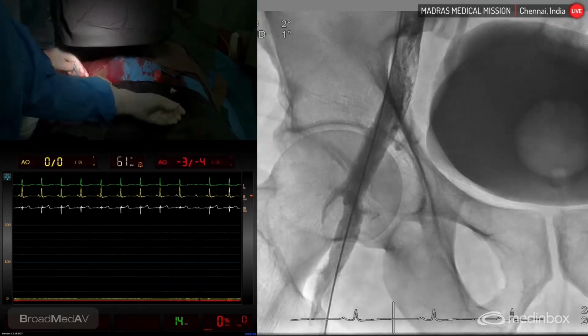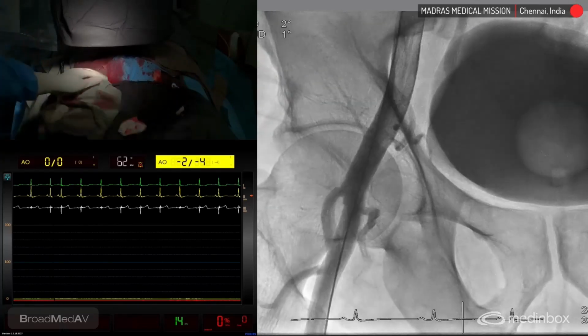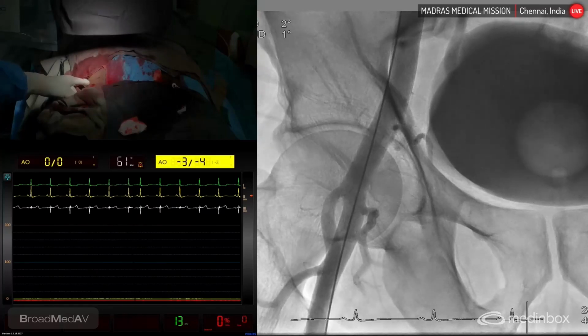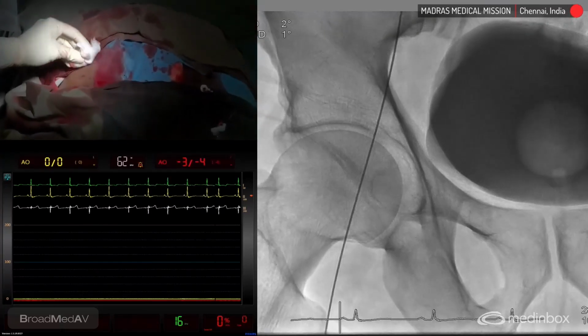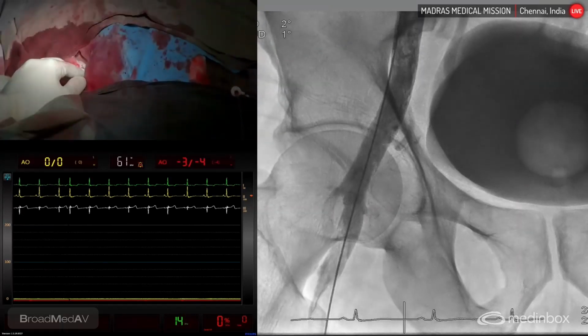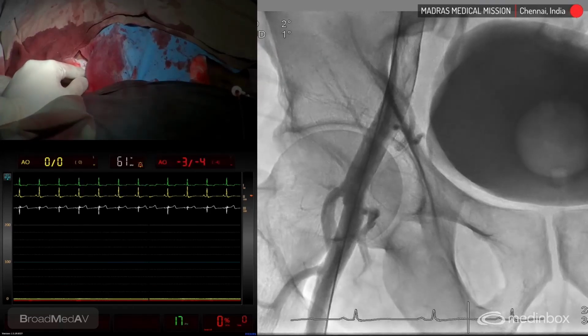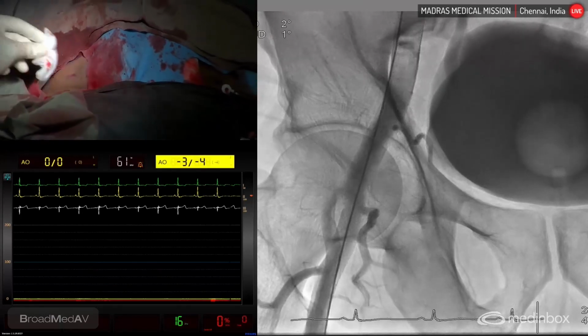So we can see absolutely a clean femoral artery with a good superficial femoral flow. And you can see the site here, just high up. The site is well controlled. So this is how, when one or two ProGlides get caught in a large vessel access, we can use the collagen based device and bidirectional tamponade to manage the vascular access complication. Over to Adilan, sir.